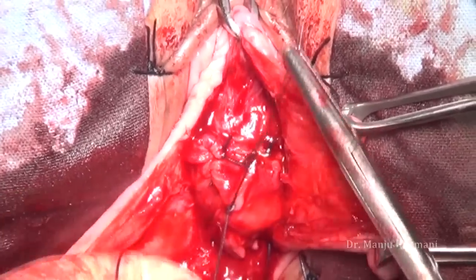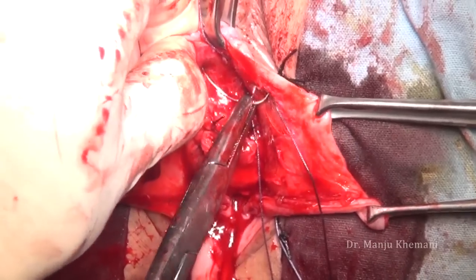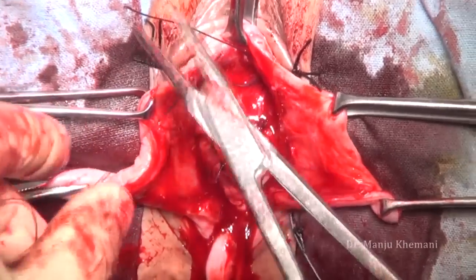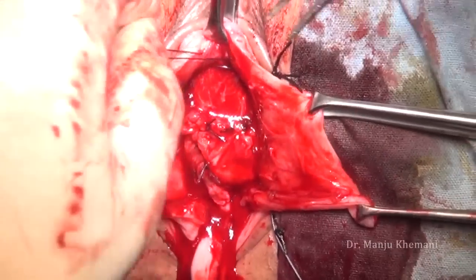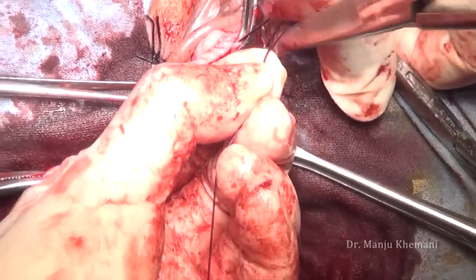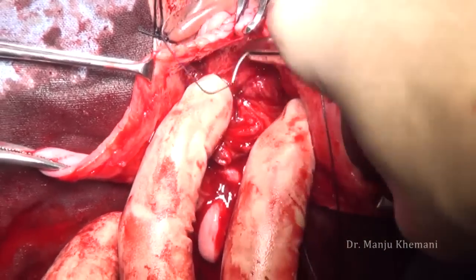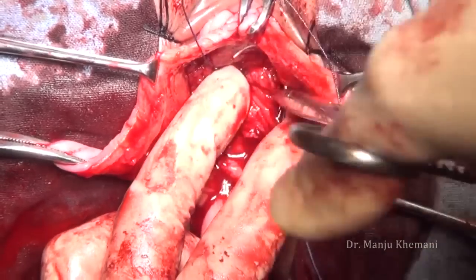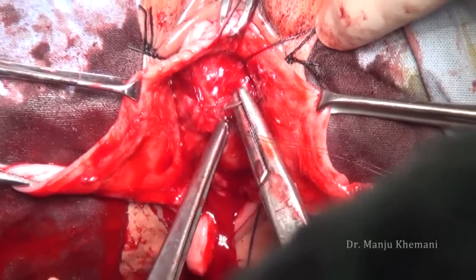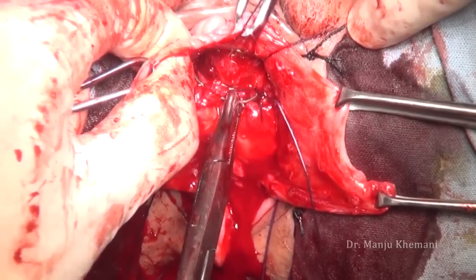Once you have closed all these tears you realize your cystocele is reduced drastically. All the tears in the pubocervical septum are closed. Now I am plicating the vesicovaginal fascia — fascia never degenerates, it just redirects; one has to have the correct technique to identify it. Keep on taking these sutures and hold them — they are all tied later, because if you tie the first suture it will be difficult to take the suture below. This suture on the pubocervical septum closes the dead space.